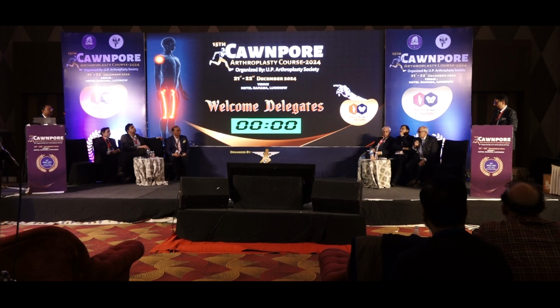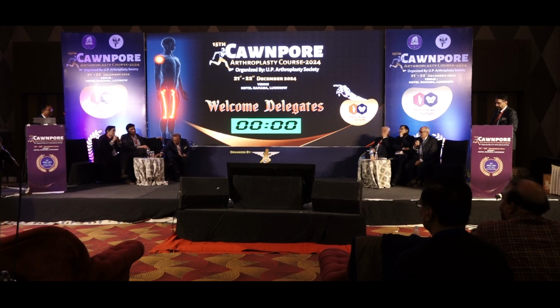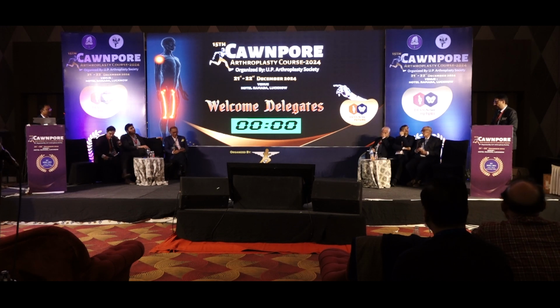Number one. And number two, lastly, I would like to know from the house, is there some joint replacement, anterior cruciate preserving? Bicruciate preserving was there. It is a bicruciate preserving knee in which they leave an island in between, but it failed miserably in the registry data, so that was withdrawn from the market.